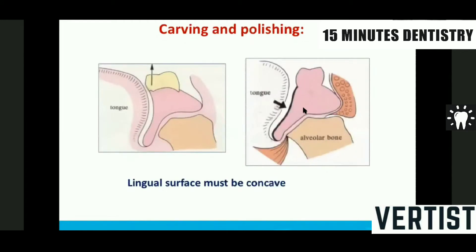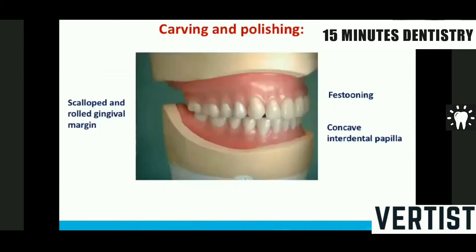The second thing is that all the buccal and lingual surfaces of the denture — the polished surface — have to be concave. The reason it should be concave is that the tongue has to rest in this concavity and the buccal musculature also has to rest in the concavity. This is the second principle while carving and polishing.